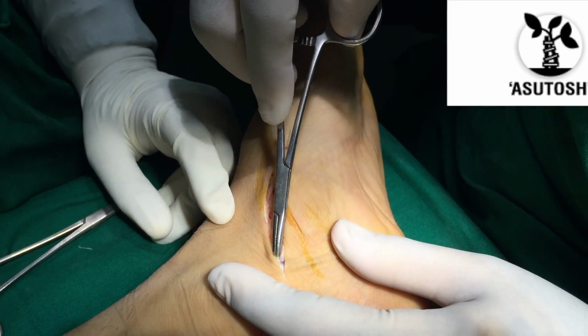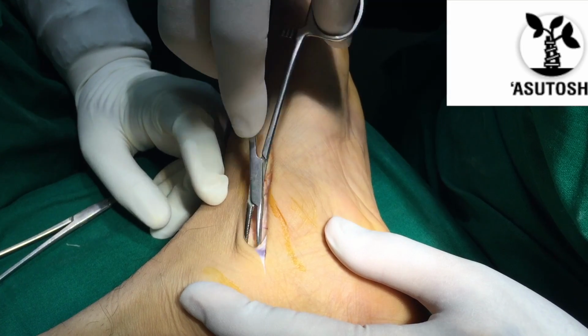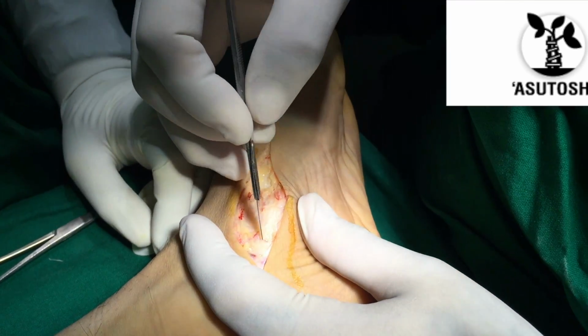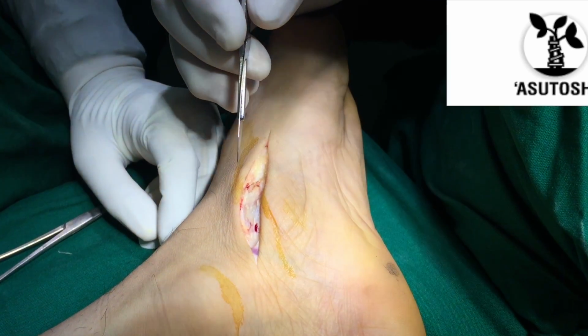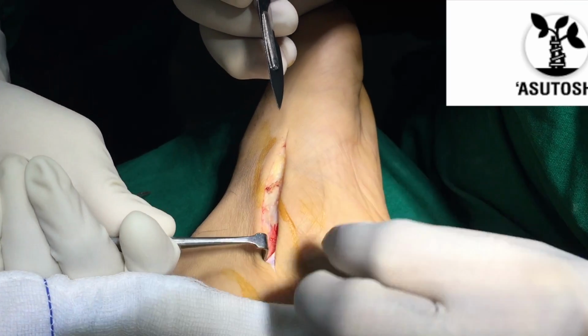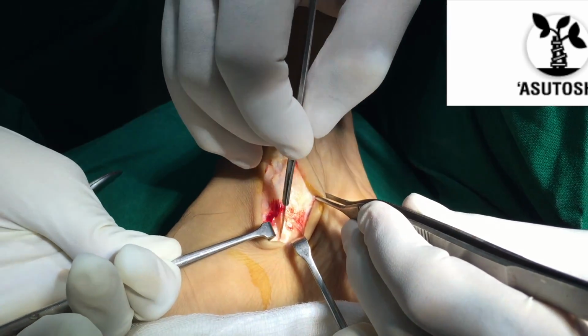Now we'll try to isolate this vessel and hold it back with the retractor. However, this is by choice. There's no hard and fast rule as to coagulation. We are now dissecting into the tendon sheath. We are holding back this venous structure with the retractor.